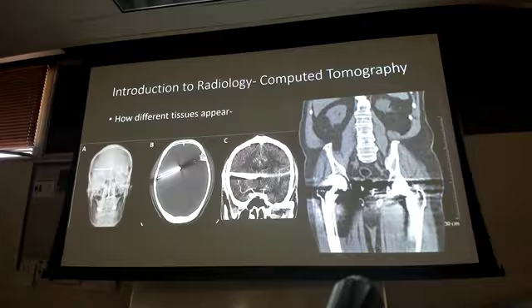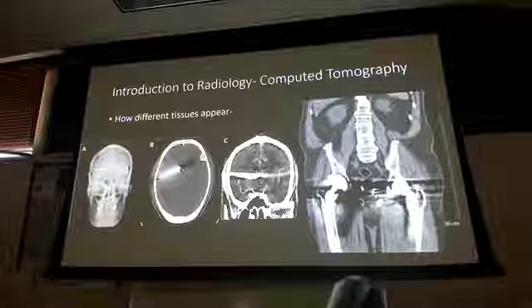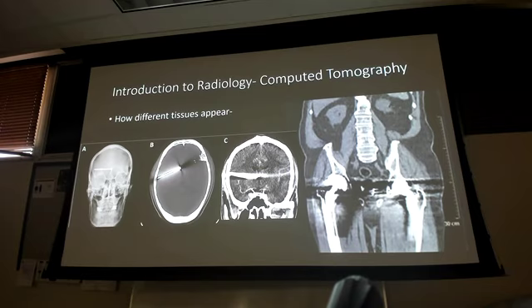Look how bright white my nail is, right? And you can see these little starring effects coming off of it. So that's just some artifact because that must have been a really dense nail and the CT caused that. Could there be air because it came through the head a little bit? Maybe, but not necessarily that much. This is more just artifact because you can see a thin black line around the whole thing. That's because it's not getting any data from that, because the metal is just reflecting off all that radiation. Same thing on my slice right here. So sometimes CT can hinder, but you still gotta get it done to get the detail you need.